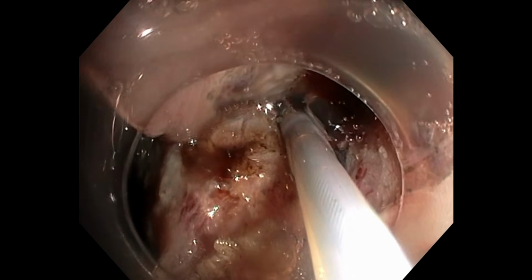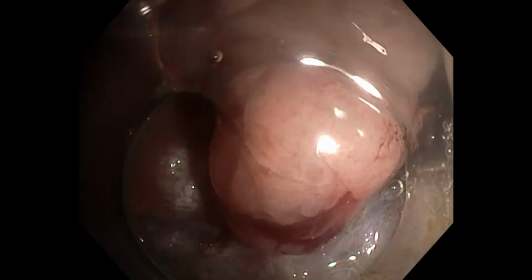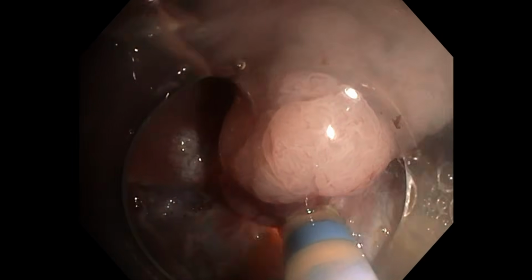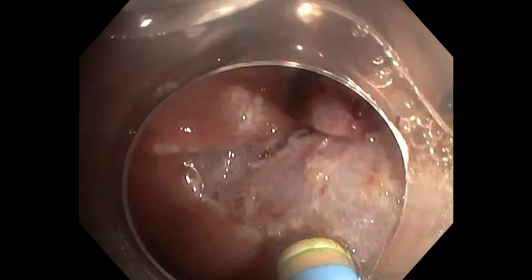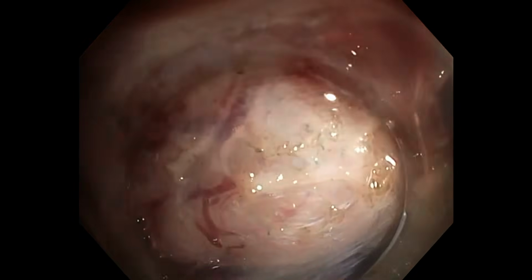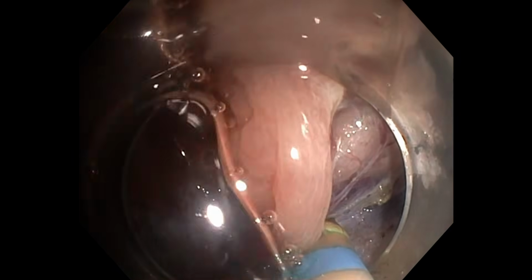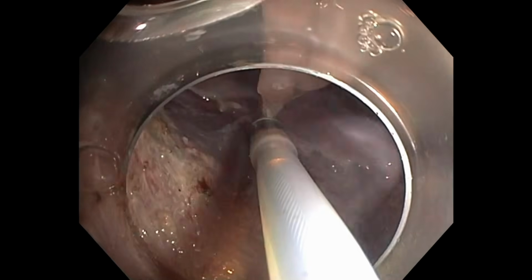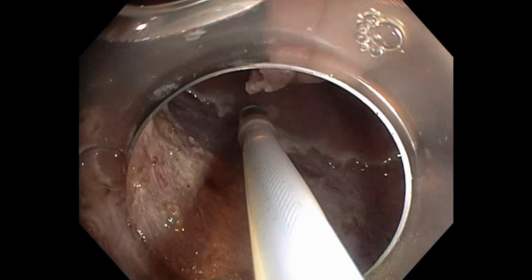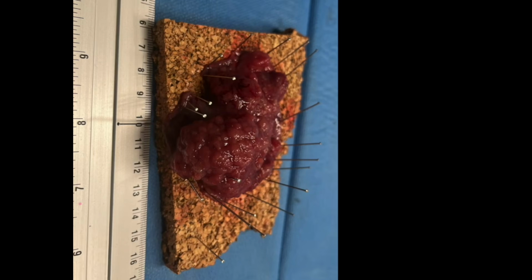Your goal is to join the two parts of the blue with a kind of virtual representation of the cutting line, even if in the center of the muscle retracting sign you will not be able to really see where you should cut. It's the help of the two blue areas that will help you to find the exit and achieve the resection at the end, with usually a kind of yellowish fibrotic tissue in the center.